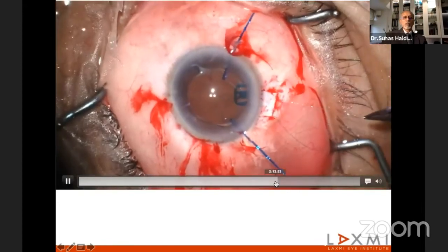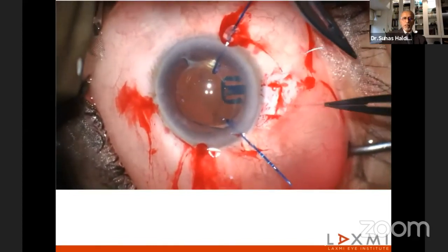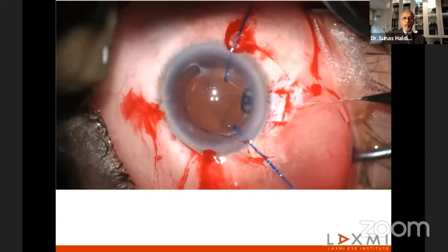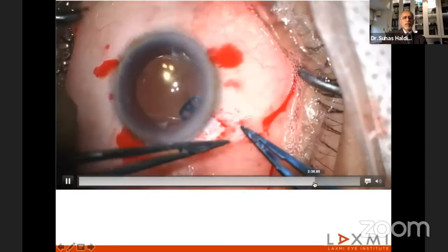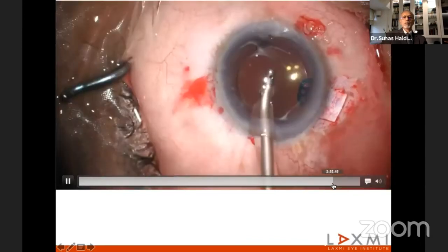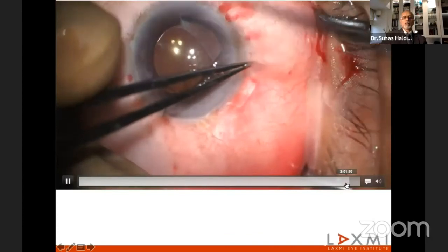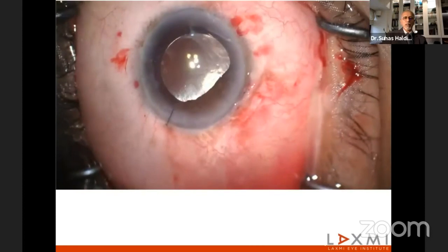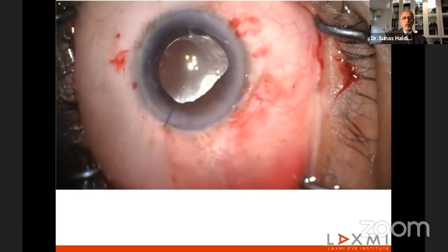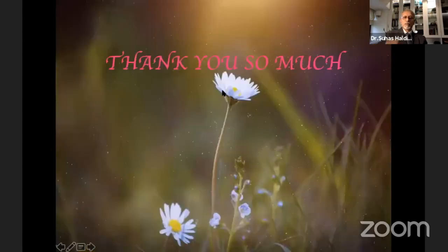So here, the clip is tied, and the entire anteriorly dislocated bag is pushed back, and the pupil is brought in, and at the end of it, he recovers his vision well. And the last picture at the end of the surgery, when I use glue to close that conjunctiva, is something like this. But then subsequently that pupil retained its shape. So these were some of the pieces I thought I would share with you.